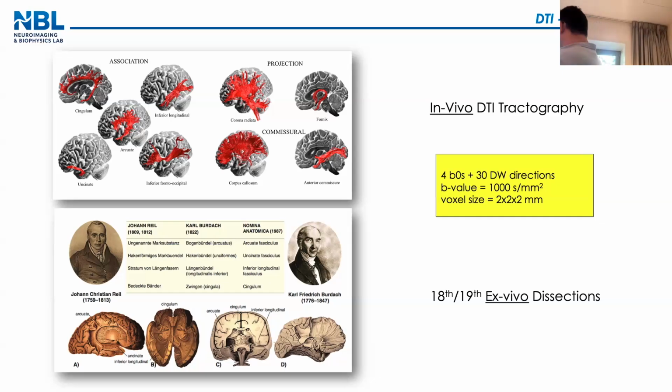And in terms of acquisition, we started with, again, initially 30 directions taking maybe 20, 30 minutes. Today, as I said, it might take probably a 2 minute scan with a multiband sequence, something like that. And this is, as I said before, a reasonable acquisition if you want to do just basic DTI. You don't have time for anything else.